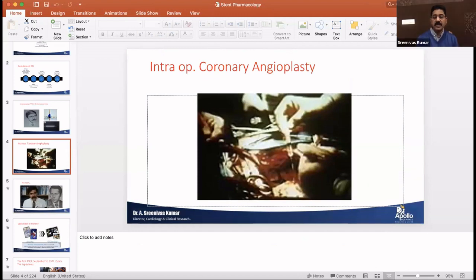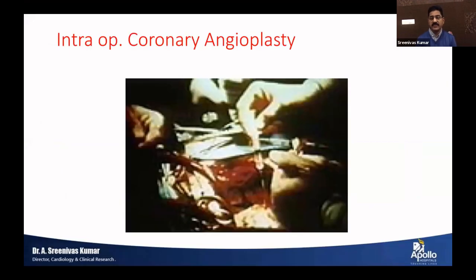Okay, no problem. So what this shows is when Andreas Gruentzig felt that balloon inflation would work for removing the stenosis, his boss and various other people thought he was a mad guy. Once balloons are inflated in the coronary arteries, the arteries would rupture and the patient would die. But he was very confident that it would work.